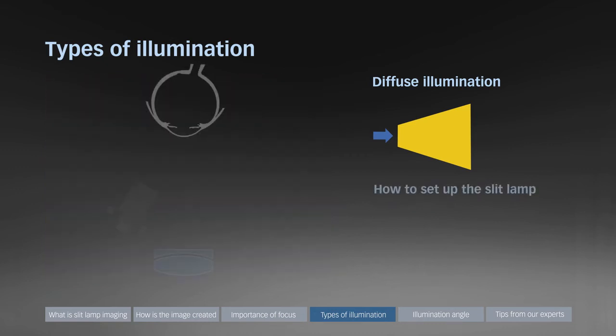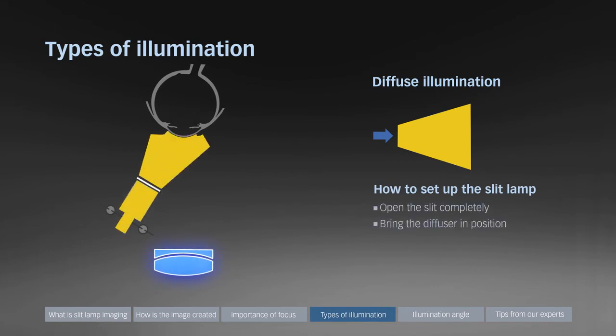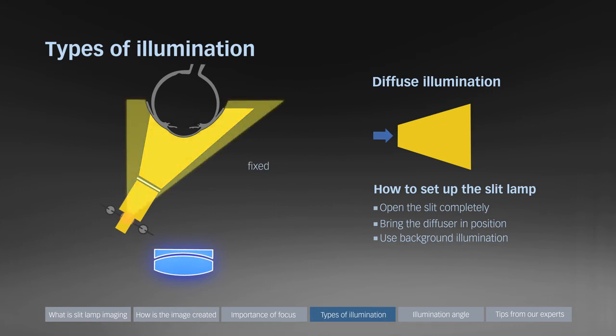To set up the slit lamp for diffuse illumination, open the slit completely, bring the diffuser in position, and use a small amount of background illumination. Haag-Streit offers two versions of background illumination: a pivoting version that allows for optimal positioning and a fixed version that is attached to the same axis as the mirror.